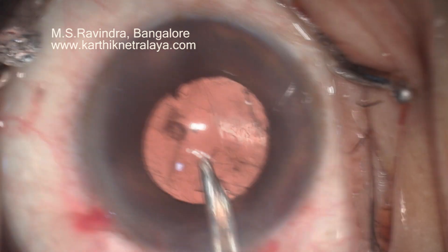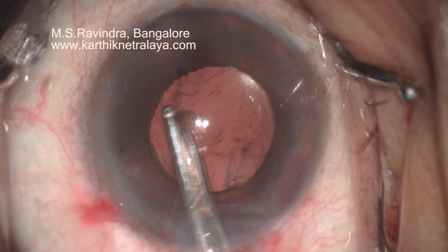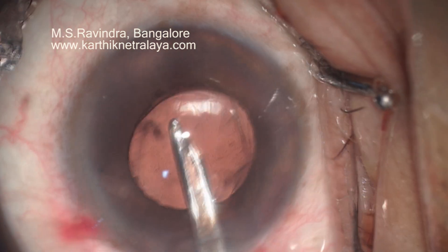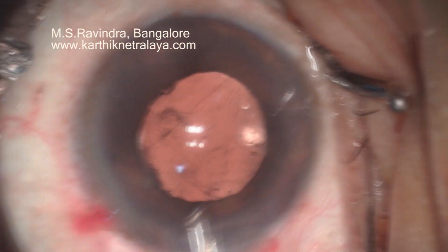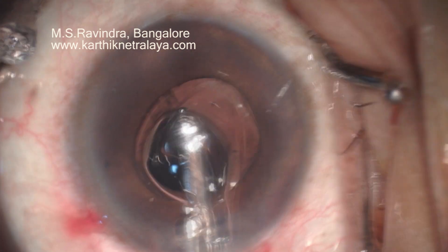I have had no problems at all — multiple times I have done this. There is no problem of uveitis-glaucoma-hyphema syndrome or chaffing of the pigment layer of the iris. It is a more feared event than anything else. There is a large capsular flap that you see.